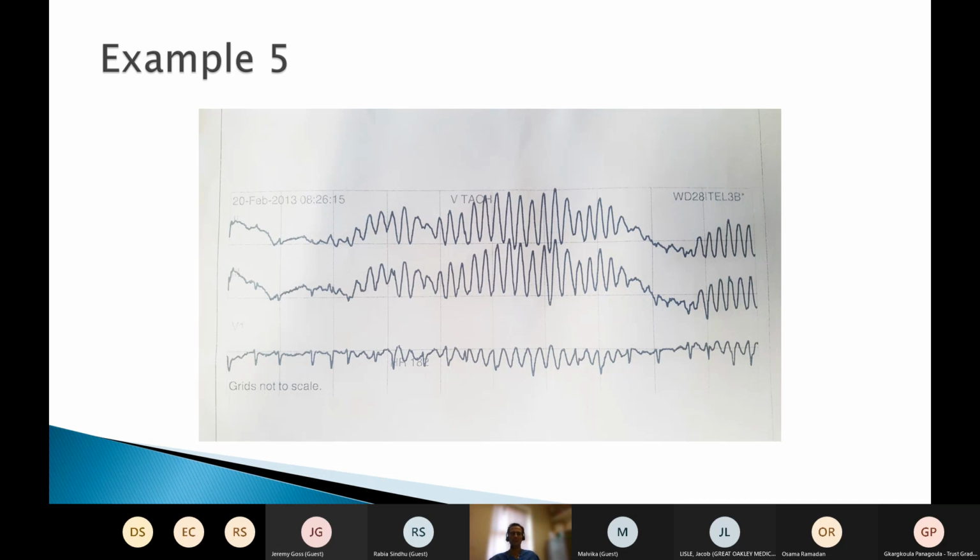Yeah, it looks like Torsade de Pointes, doesn't it? It possibly looks like VF. You can see the rhythm sort of looks as if it might be corkscrewing round. Is everybody satisfied? It's probably one of those two rhythms.